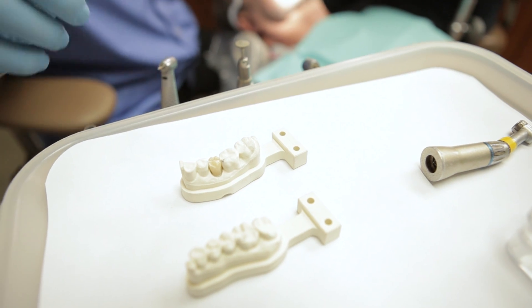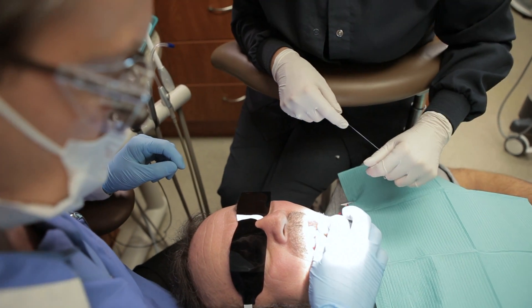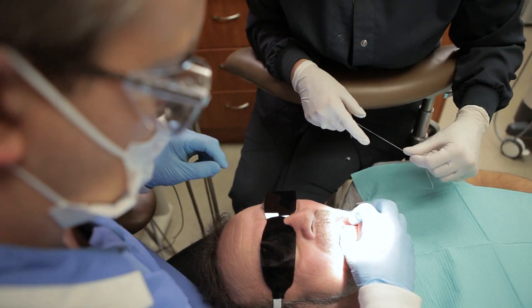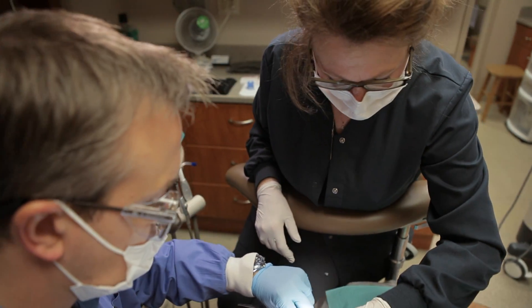There's been a number of benefits that I've seen using the iTero. One is a predictable restoration every time. By using the scanner, you're eliminating impression material altogether — it's more comfortable for the patients. It eliminates retakes and remakes of impressions. I've seen seating time significantly reduced. Align has been a great partner for me to work with. I have great customer support — if I ever need to get a hold of somebody, they're there to answer your questions.